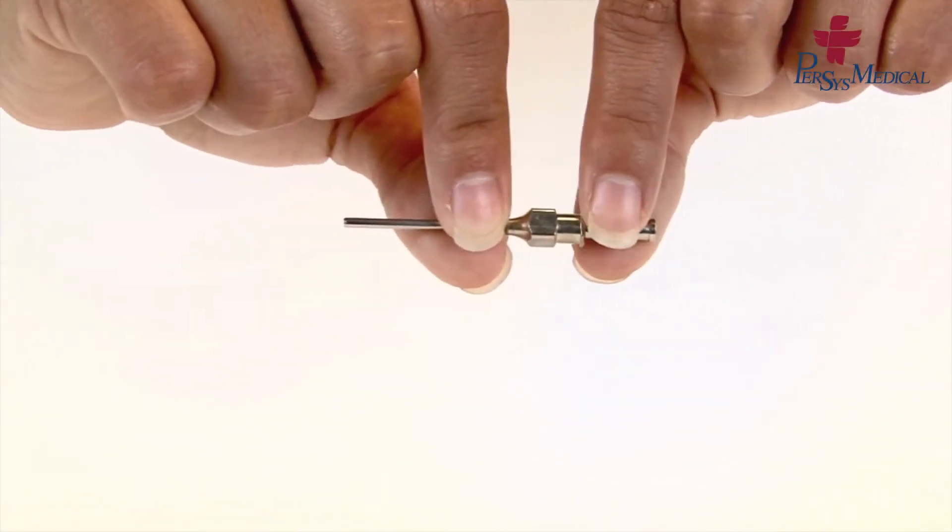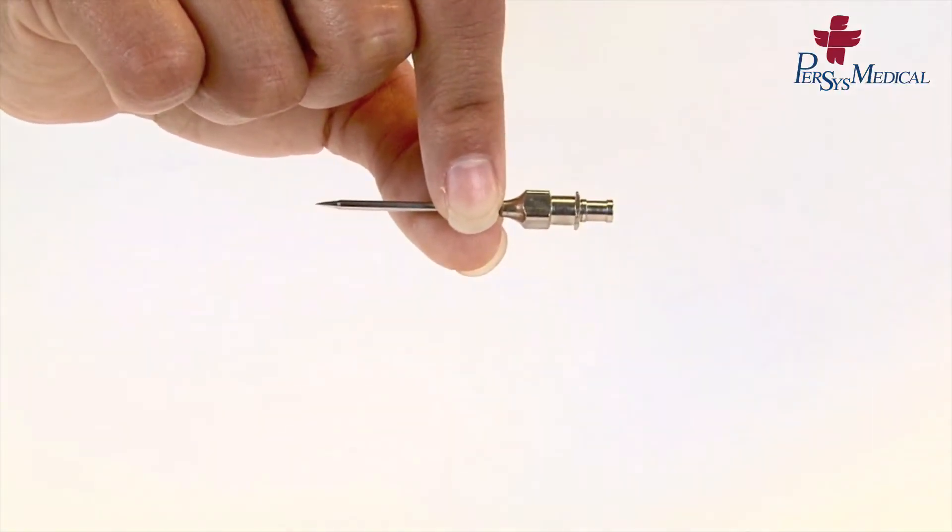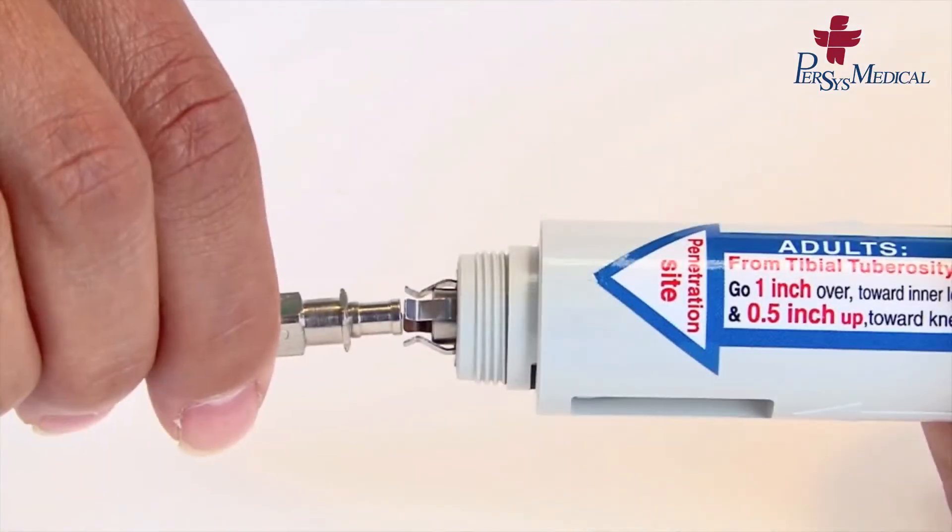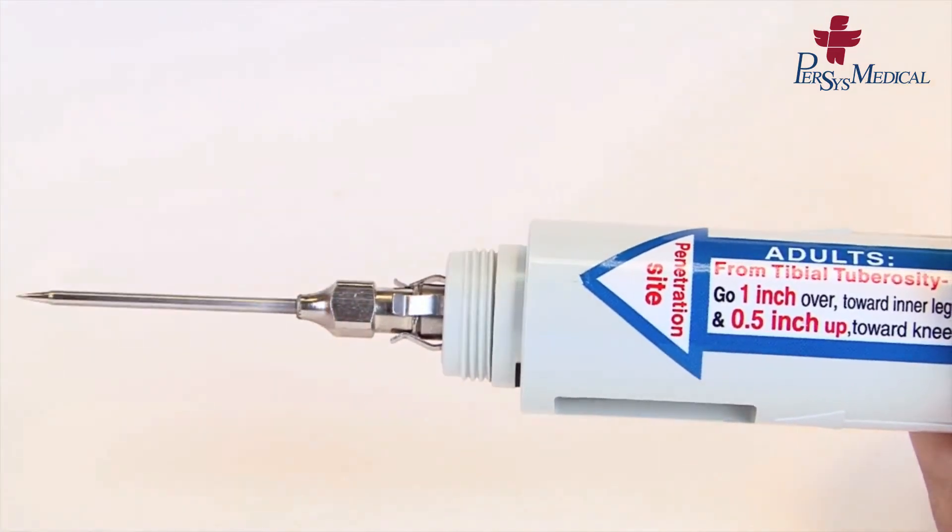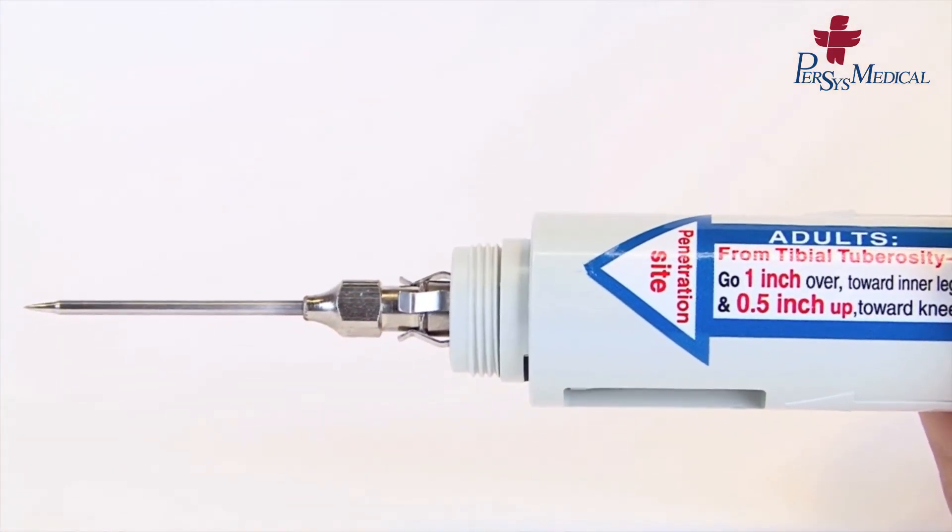Carefully place the needle into the cannula. Keeping the spring and piston pointed away from you, attach the needle and cannula to the clasp and ensure that it is secured.